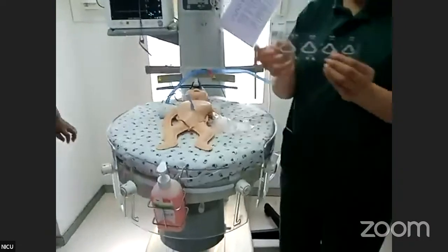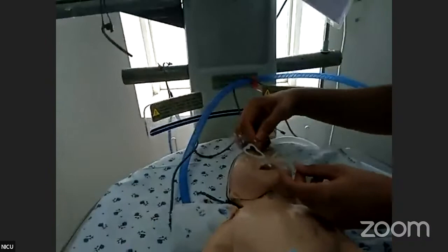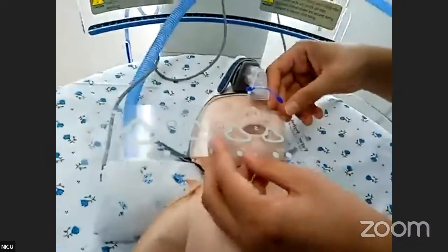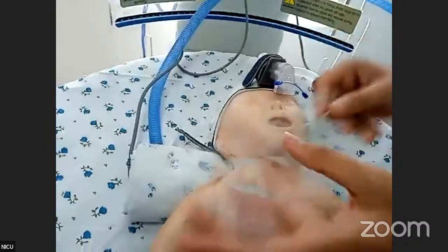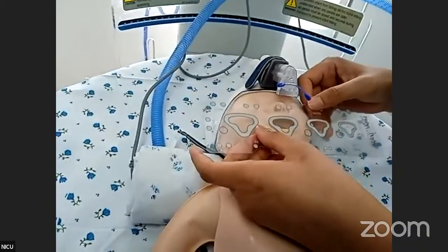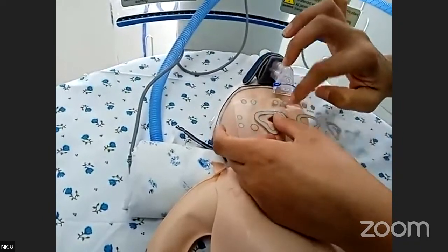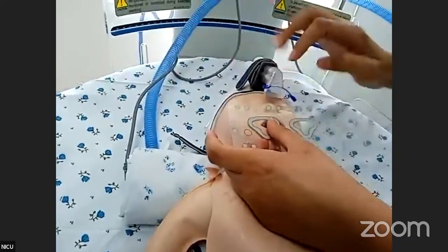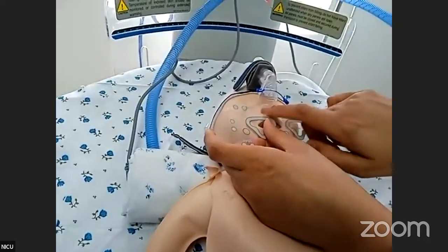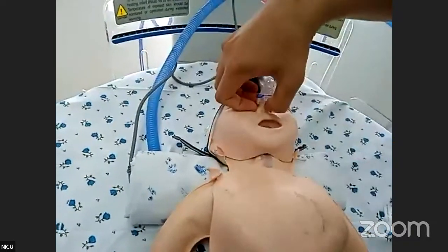So this is a nasal sizing. So when we are choosing the nasal interface, we choose that size. For example, for this baby, this is too close. The width of the columella is not optimal. So maybe this or this size, both seem to be okay, wherein the nostril size is also completely enclosing the baby's nostril and the width of the columella is also optimal. So we will choose this size, which is 55-60. 55 represents the internal diameter of the nostril and 60 represents the width of the columella part.